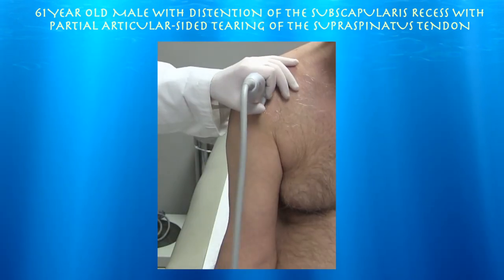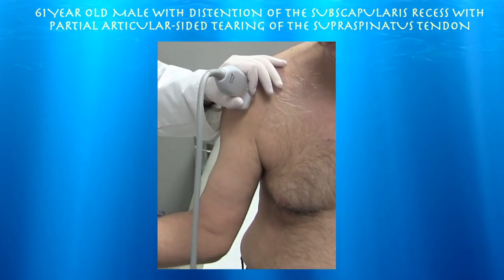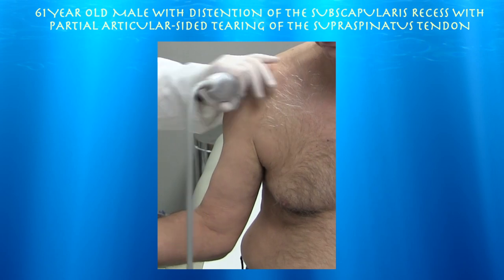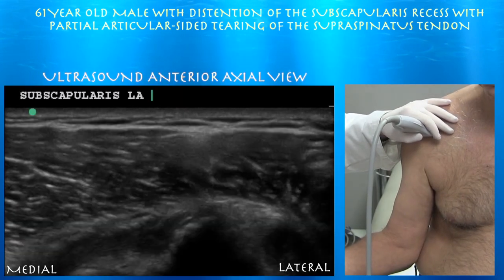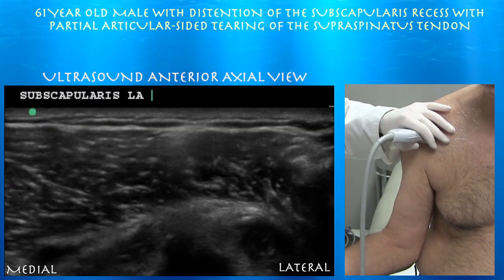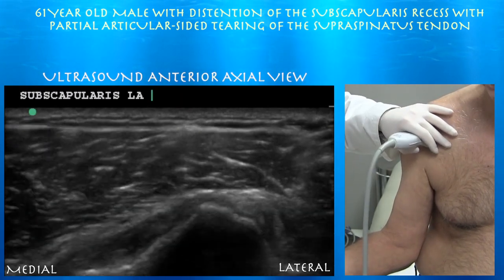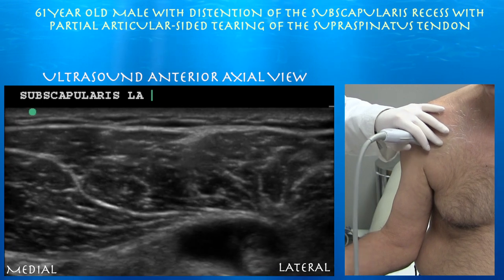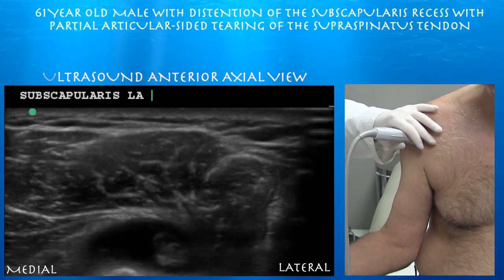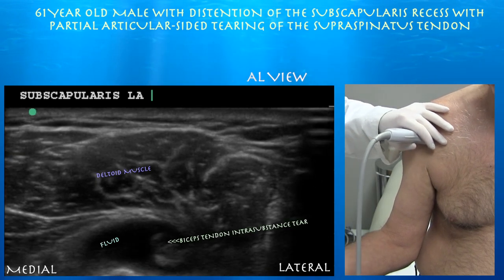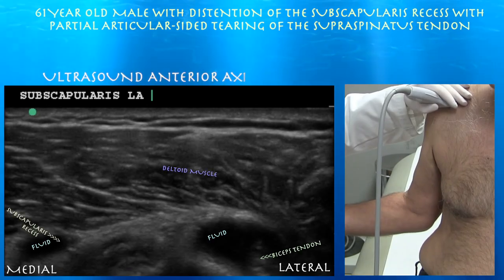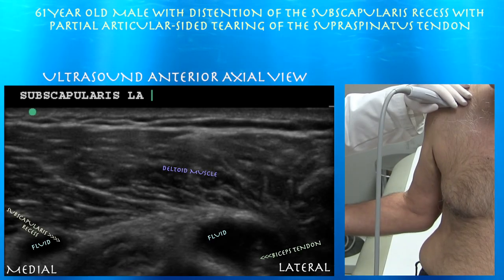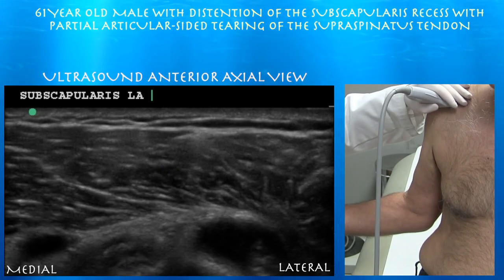Now we're going to look at the subscapularis tendon. As mentioned, there may be an intrasubstance tear — as per the MRI, they thought it was an intrasubstance tear. You can see the biceps tendon there. Here I believe is a small intrasubstance tear of the subscap tendon, which you can see in long axis to the tendon. Here again you can see some of that intrasubstance tear, and you can see both the distended bicipital sheath as well as the distended subscapularis recess.